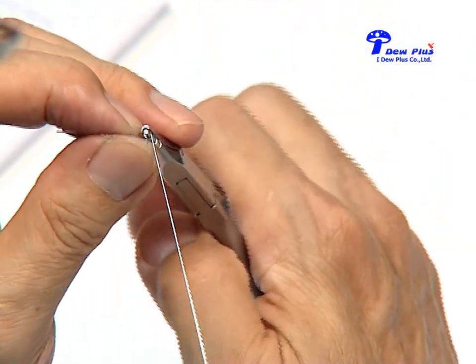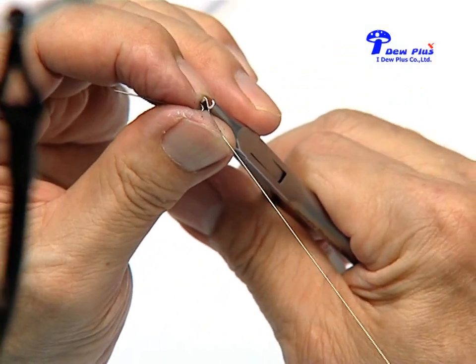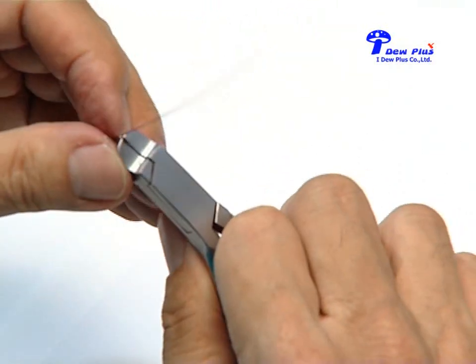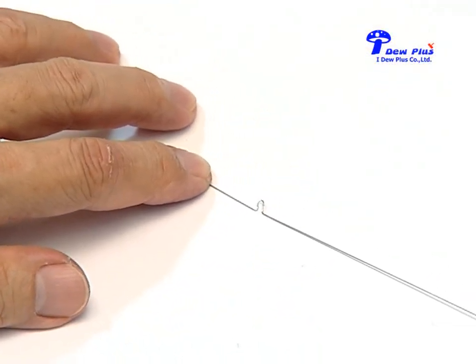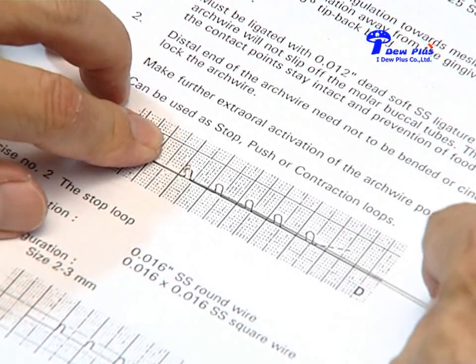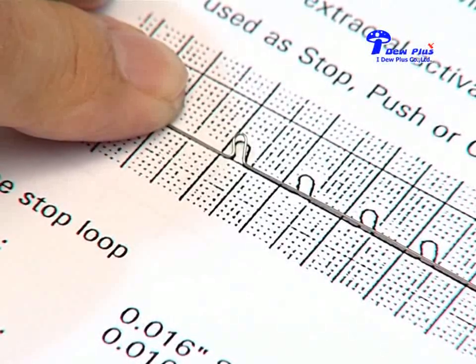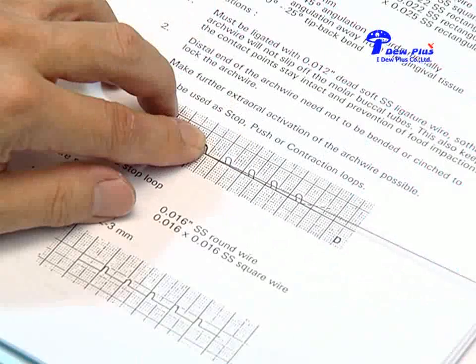Then we slowly open the beak apart. Turn it around, open the half round beak, and if we bend the distal leg, it will stay on the same level as the mesial leg. Minor adjustment can be made. Make sure that the mesial part and the distal part are in the same plane as seen here. You may check with our book on page 16. You can superimpose and you can see the actual size should be the same as in the book. The size is approximately 2 millimeter by 3 millimeter with a 45 degree angulation towards mesially.